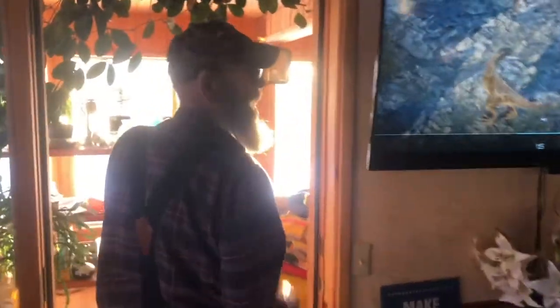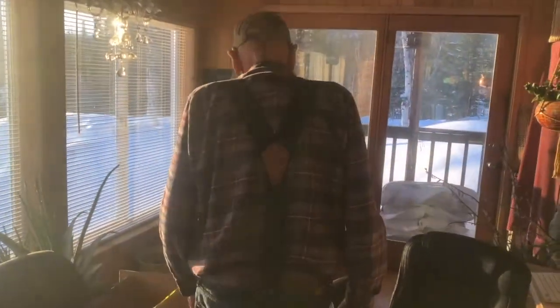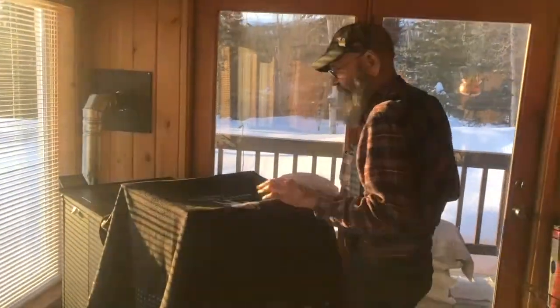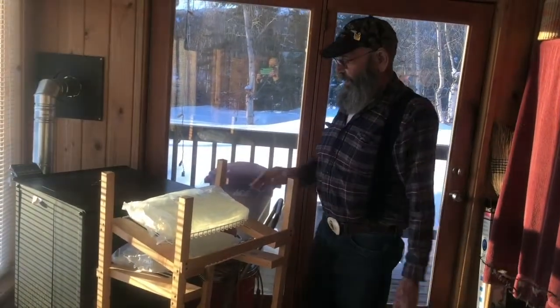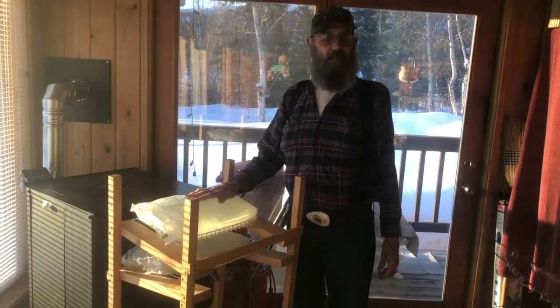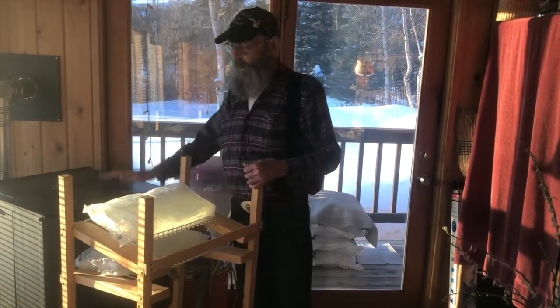Hey Pete, we're going out here to show her how we, this is where I heat my water, or my prescription, under this thing right here. And this thing gets it up to right about 98 degrees, just perfect. Pete built me this thing. This is my pellet stove.